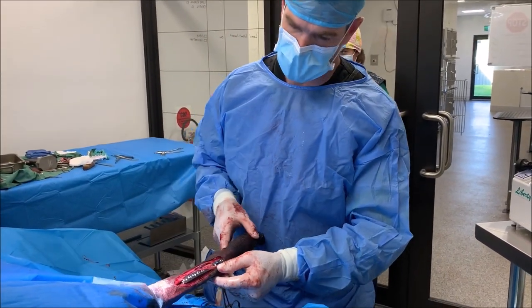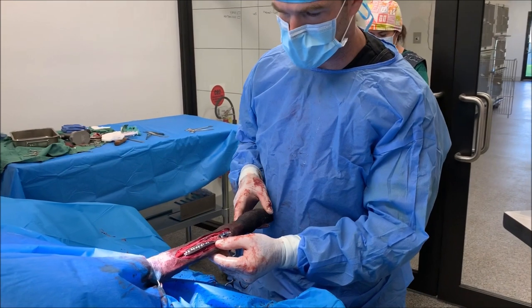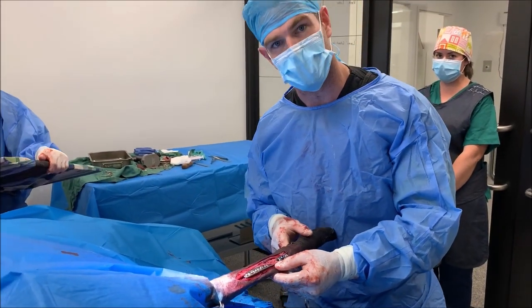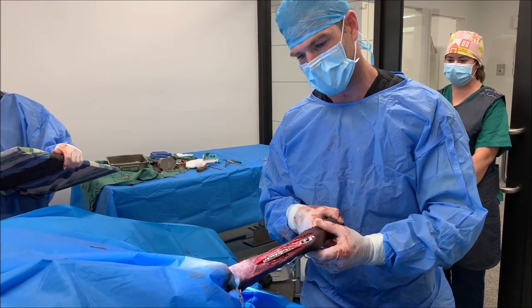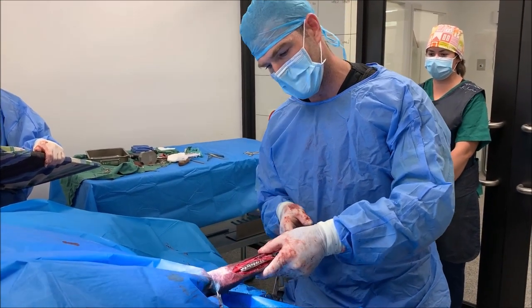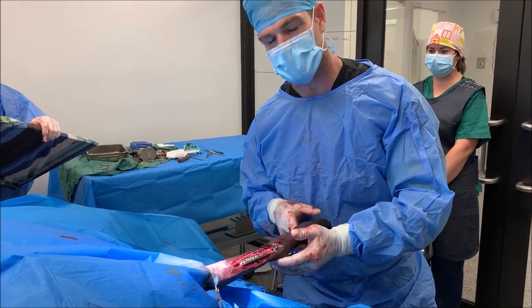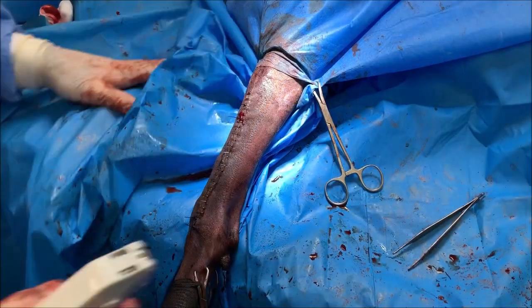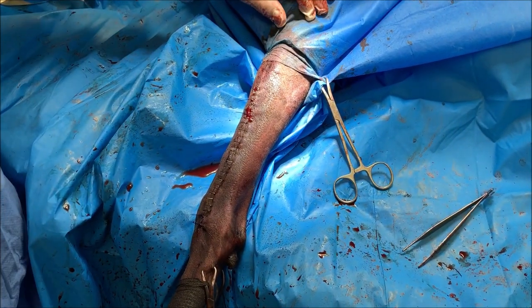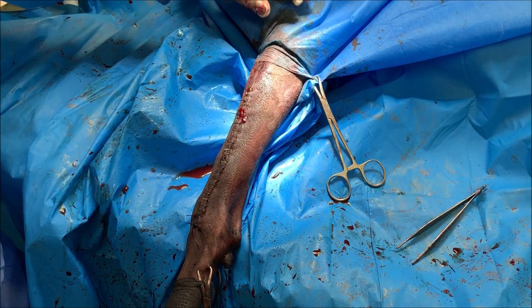The fracture has been stabilized now with a bone plate — this is a 3.5 LC DCP bone plate with all the orthopedic screws in place. You can see how solid the leg is now, and we've still got very nice carpal flexion, so I'm really happy with how this has gone. We're just going to take some post-op x-rays, all closed up, and then we'll put a cast on. Fingers crossed everything goes well.